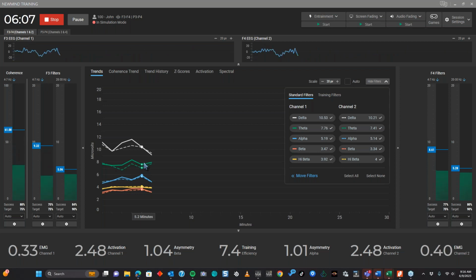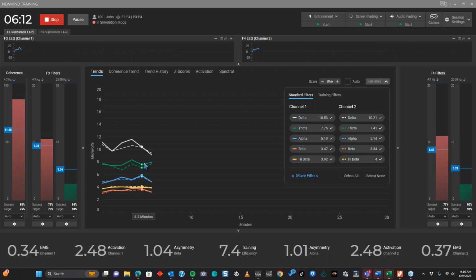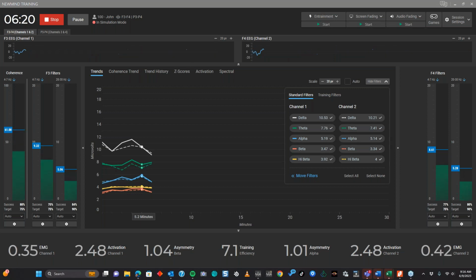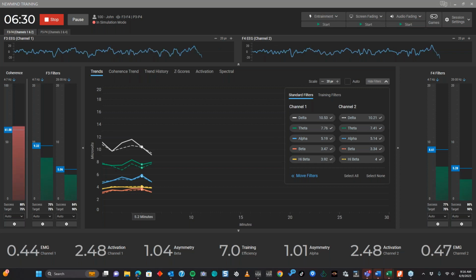range that I just gave for beta, the 5 to 6 microvolts plus or minus 2, encompasses the entire range of our normative database. So that would be from age 5 to age 90, and that's a pretty small little window. Of course, we would expect the kiddos that we're training to be generally running higher than average power.